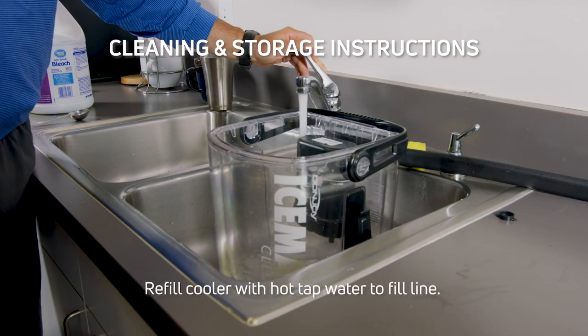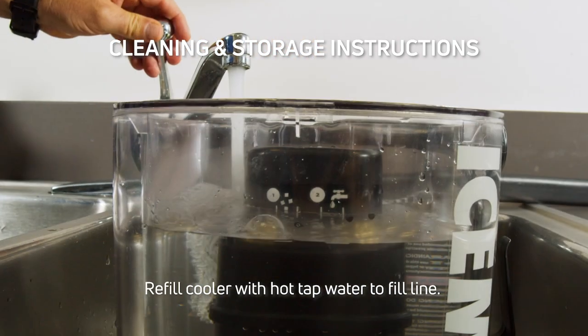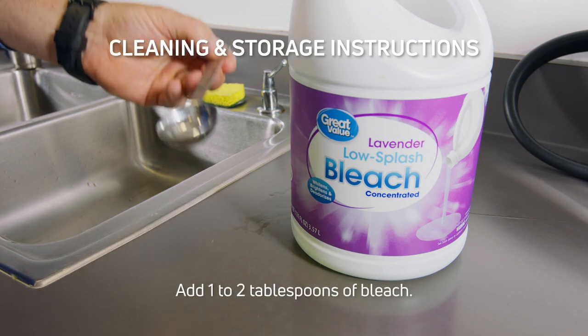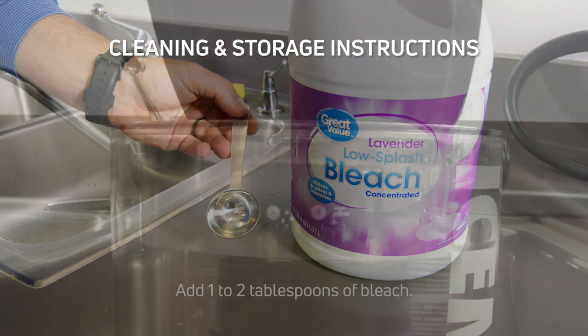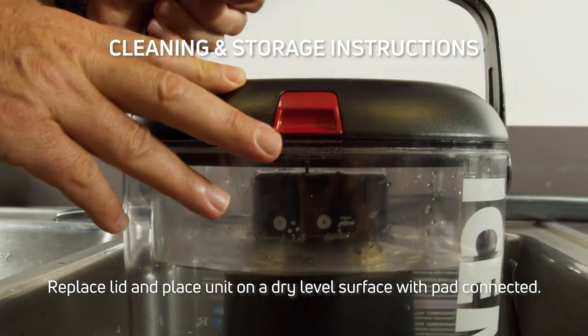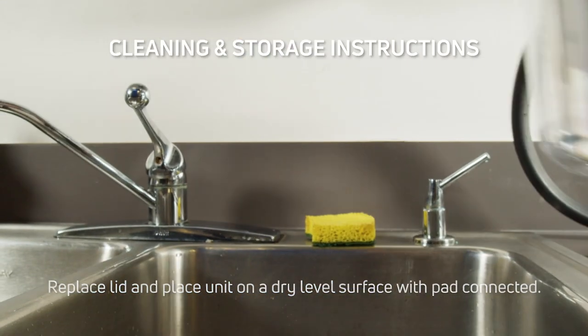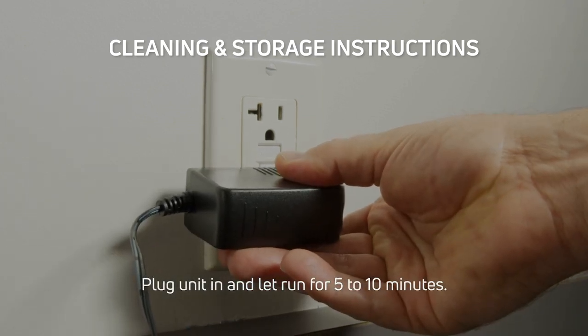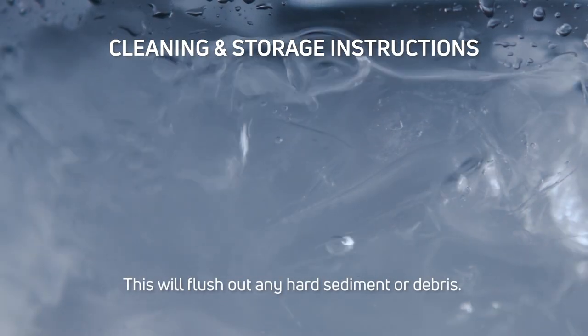Refill the cooler with hot tap water to the fill line. Add 1 to 2 tablespoons of bleach. Replace the lid and place the unit on a dry, level surface with the pad connected. Plug the unit in and let it run for 5 to 10 minutes. This will flush out any hard sediment or debris.